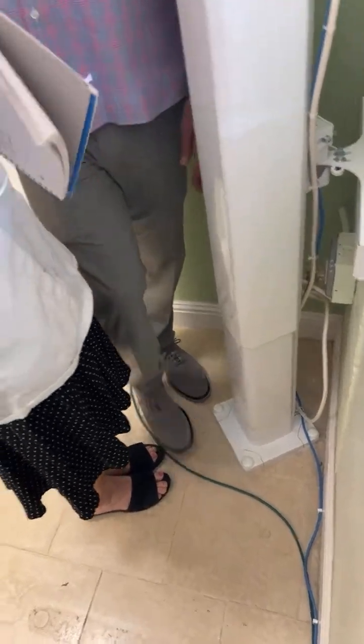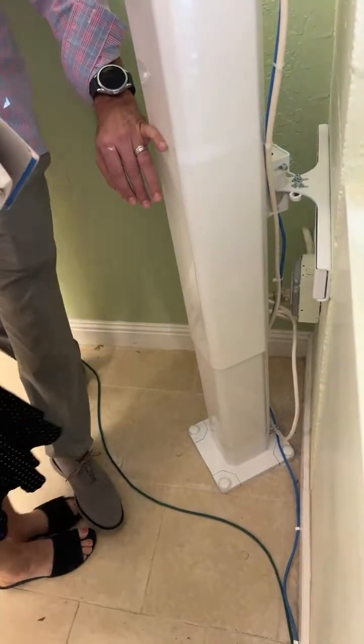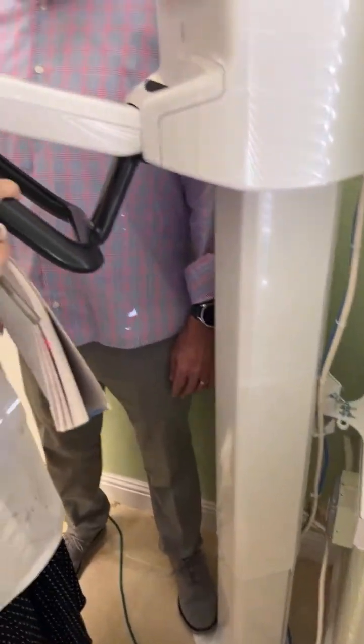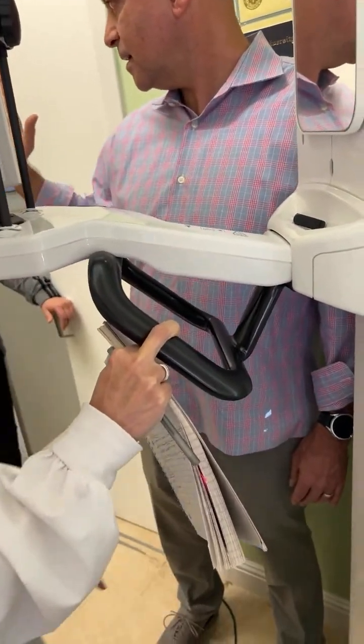You guys see that? I have to bend my body a little bit back. Let me put my foot in here. About right there. A little bend on the back. You want them back a little bit. You don't want them water skiing.